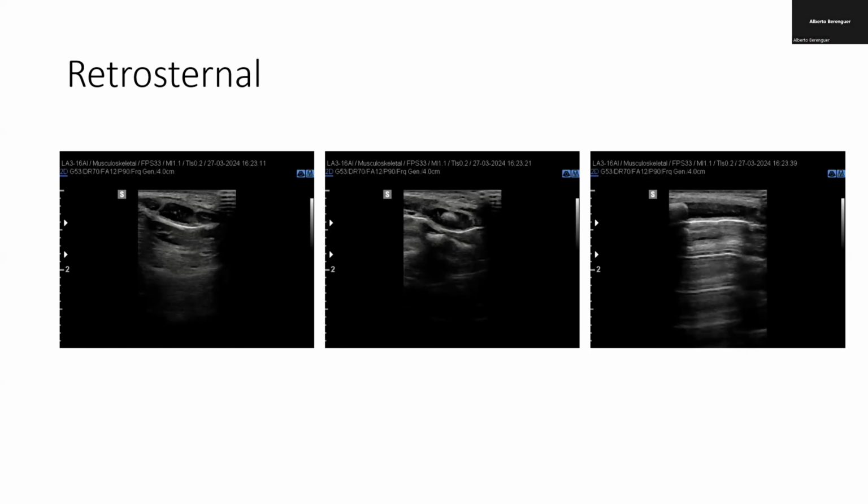Yes, Anna, it's the same. Sometimes when we do the cardiac ultrasound, one tip is when we can't see the heart very well, we can think about the external air as well, because we lose the window. Yes, that's a very good point. So again, if you've got air in the chest, you lose the mediastinal window. You lose the window to actually see the heart. In particular, if you've got a left-sided pneumothorax, the apical view will be quite difficult to get. So that's a fantastic point.